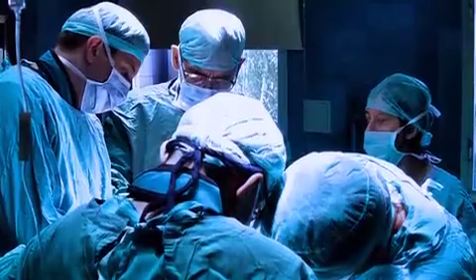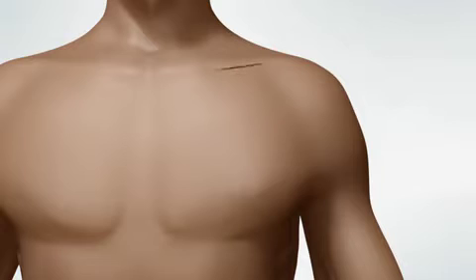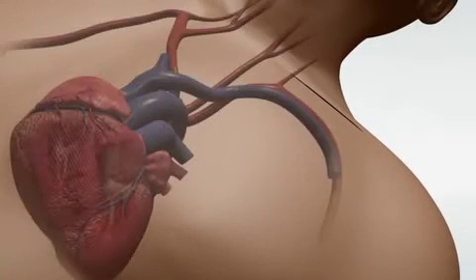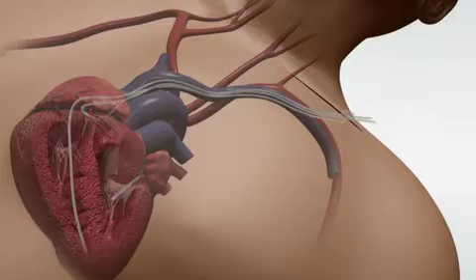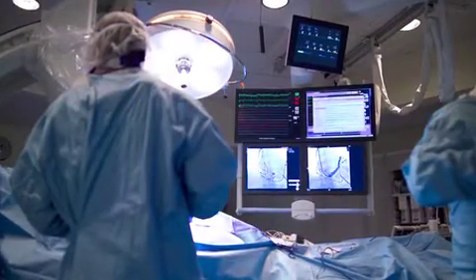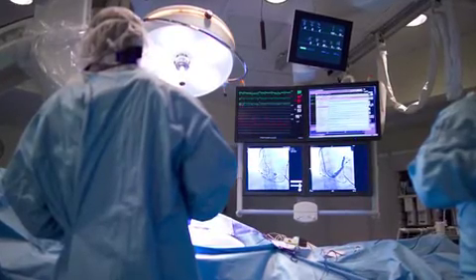The procedure to place a CRT-P or CRT-D typically follows these steps. Your doctor makes a small cut in the upper chest and locates a vein. A small puncture is made in the vein and the lead wires are guided down the vein to the heart. Your doctor can see where the leads are going by watching a video screen with real-time moving x-rays called fluoroscopy.